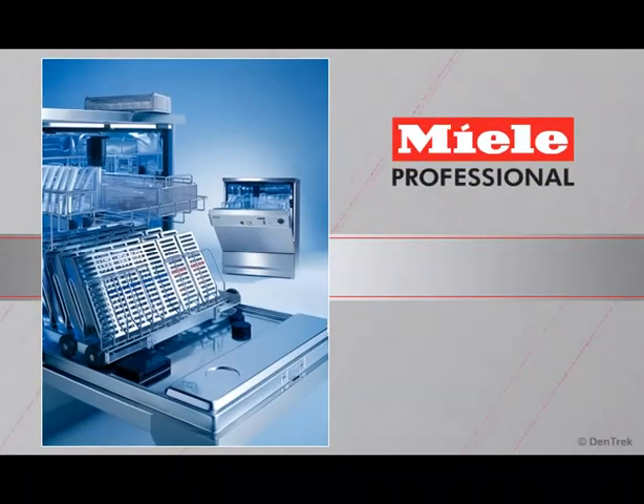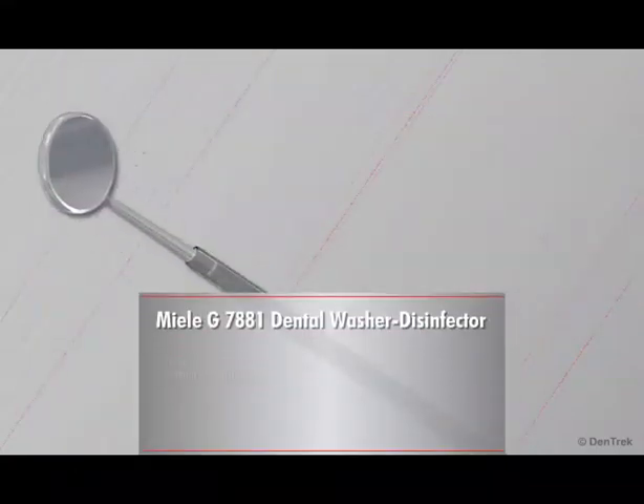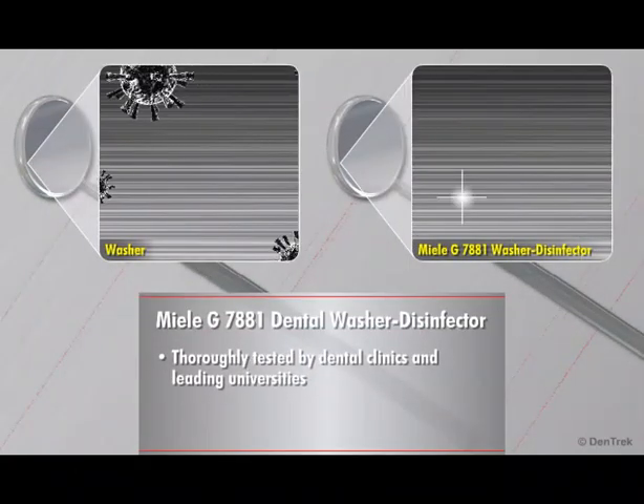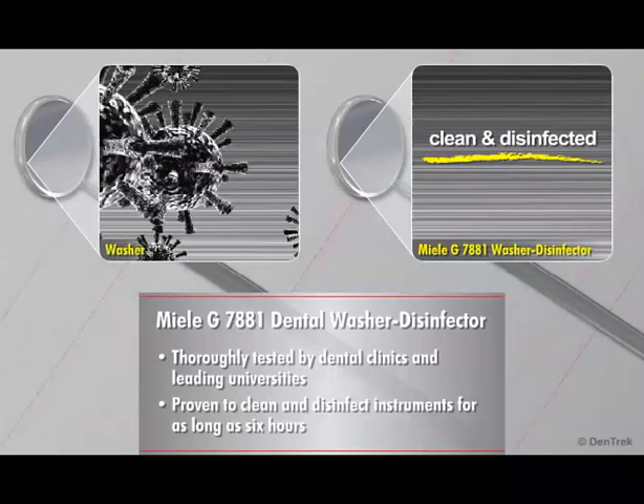Miele has a solution. Specially designed to meet the needs of busy dental practices, the Miele G7881 Dental Washer Disinfector offers an efficient, safe, and cost-effective method for the cleaning and thermal disinfecting of dental instruments. Thoroughly tested by dental clinics and leading universities, the Miele G7881 has been proven to clean and disinfect dental instruments that have been contaminated with dried blood and harmful organisms for as long as six hours.